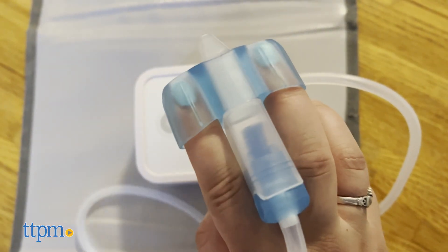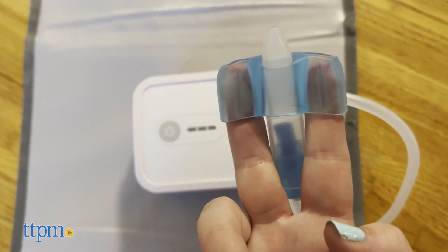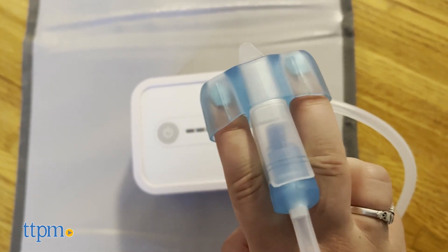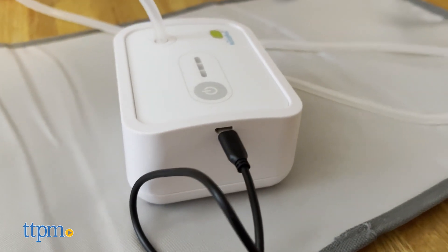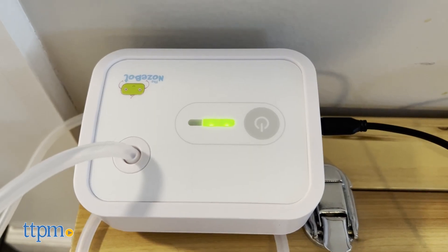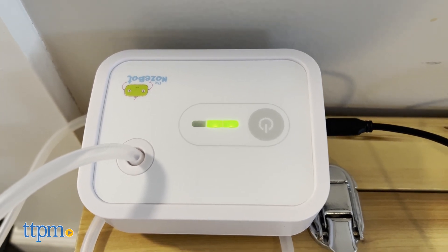It comes with a rechargeable unit, charger, BPA-free tubing, nose piece, and 12 extra disposable filters. It's portable and rechargeable using a micro-USB cord, which could also be charged in your car if need be. The lights on the machine will turn yellow when it needs to be recharged.